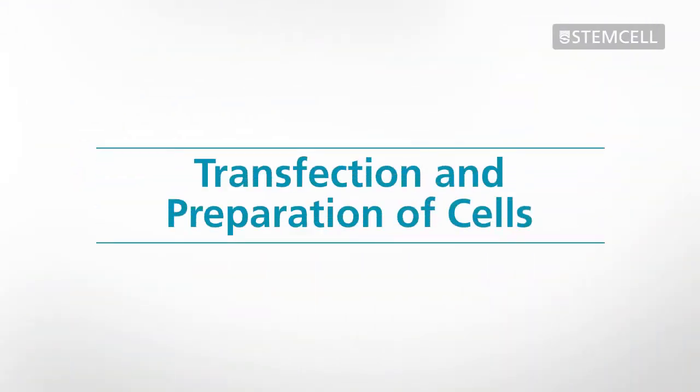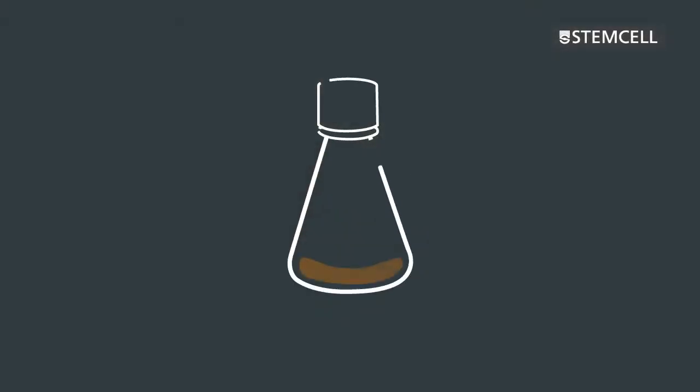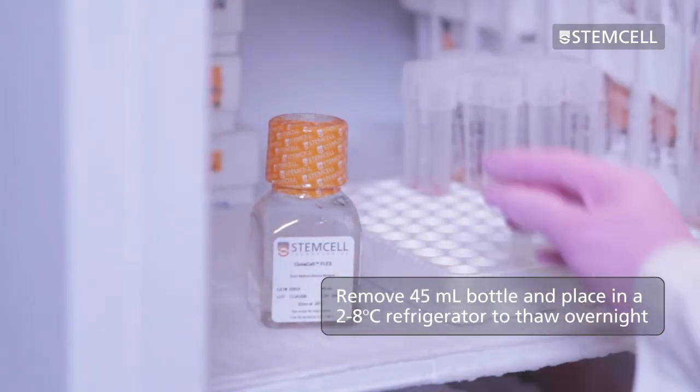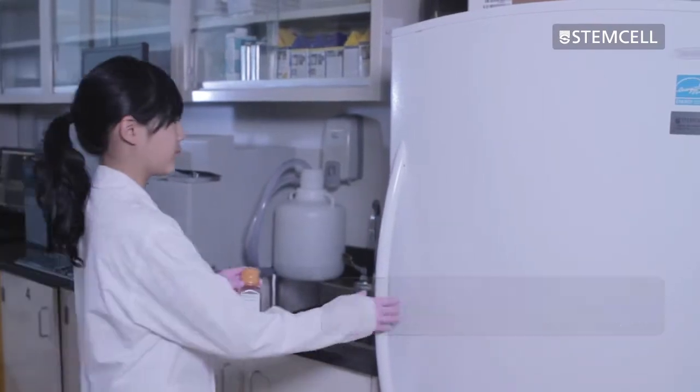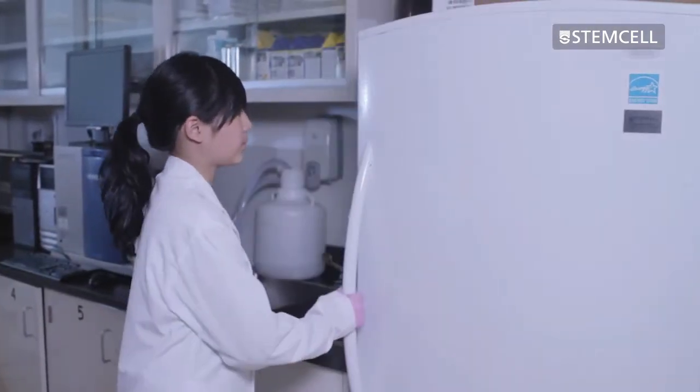ClonaCell Flex can be used to clone a variety of cell types, including CHO cells and hybridomas. For the 96-well plate procedure, like the standard semi-solid cloning procedure, these cells can be prepared using a variety of methods. Introduce your gene of interest or otherwise prepare your cells for selection and cloning using your normal protocol. Depending on the cell type, cells may require an appropriate incubation period prior to selection and cloning. On the same day as transfection, remove the 45-milliliter bottle of ClonaCell Flex semi-solid base medium from the freezer and place it in a refrigerator to thaw at 4 degrees Celsius overnight. The thawed medium will be required the next day.